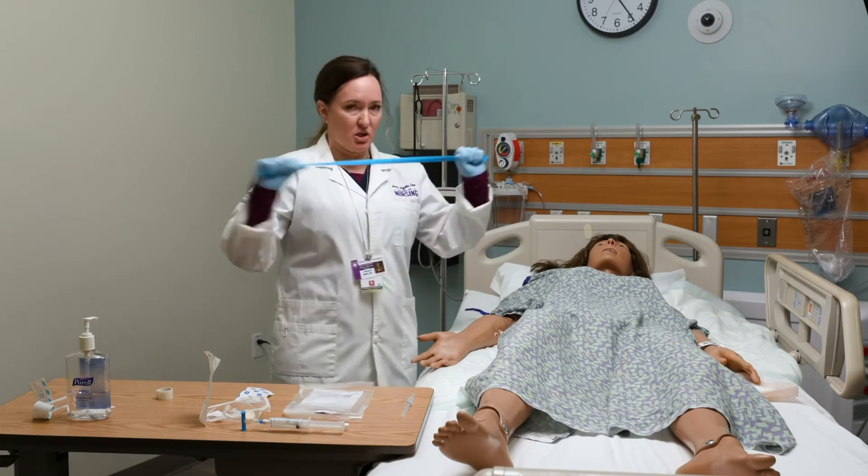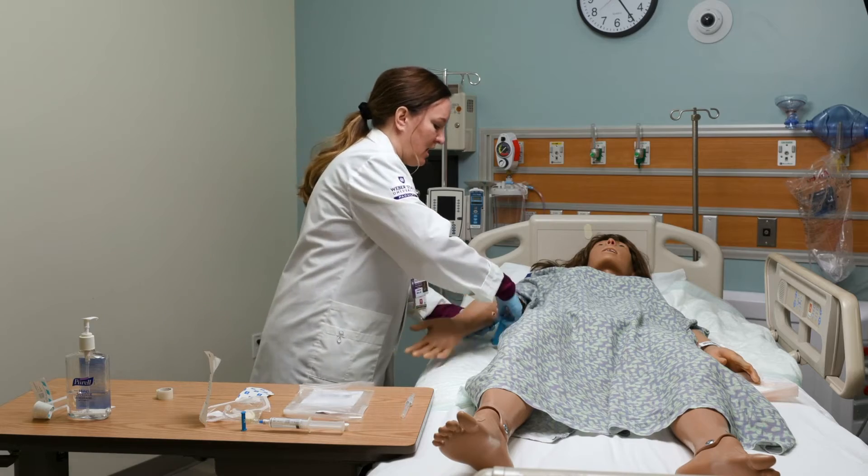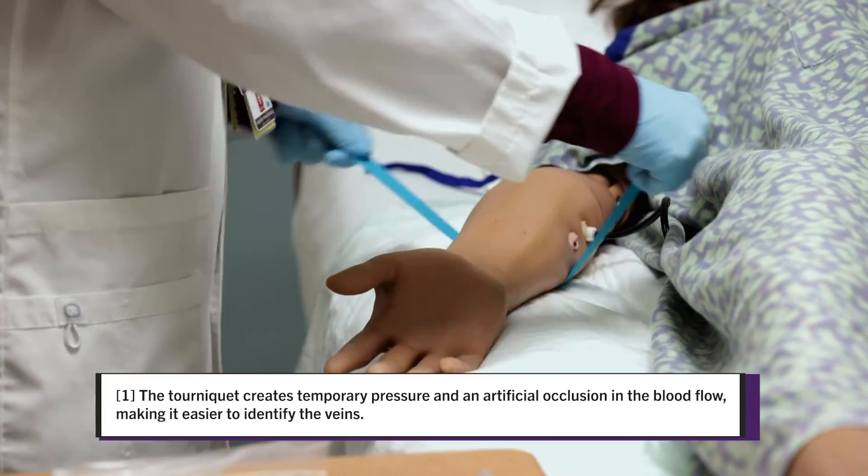Now it's time to put the tourniquet on the patient. I always do a little test pull to make sure I have good integrity, and you want to place the tourniquet at least several inches above the site.